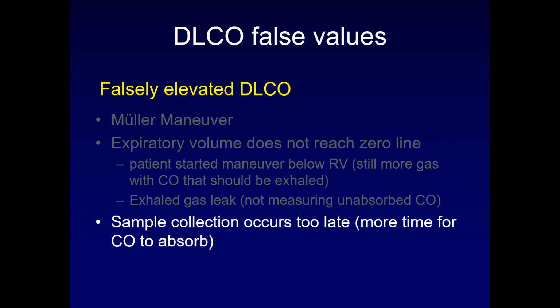The last one I'll point out, I pointed out a little earlier, if you draw the sample collection too late, that gives more time for carbon monoxide to absorb and then lead to a falsely elevated diffusion capacity.